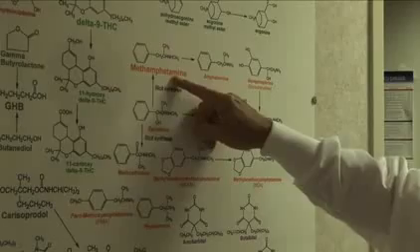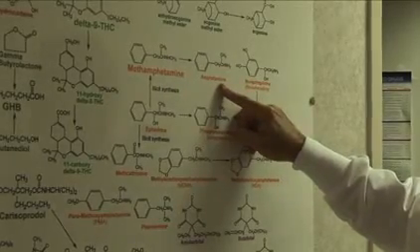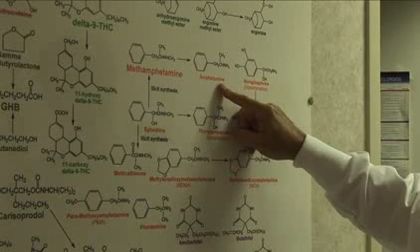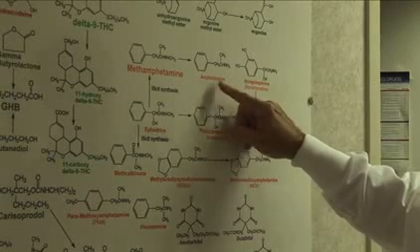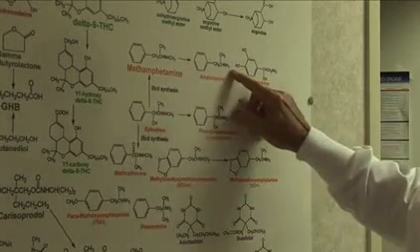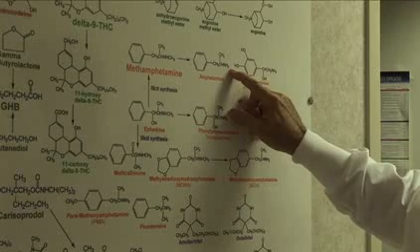Now that the structure has been identified, the chemical structure is important information. This is the chemical structure for methamphetamine. Amphetamine is another member of the same class, which is very similar in structure, but does not have this final methyl group at its end. In its place, it has a simple hydrogen atom.